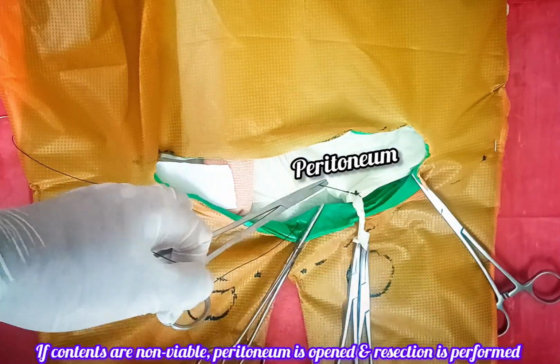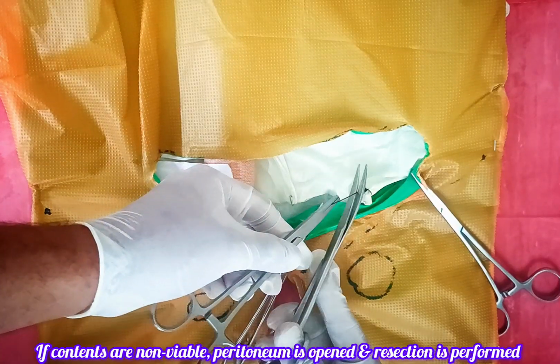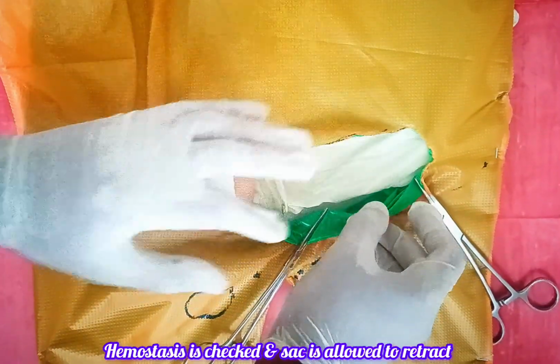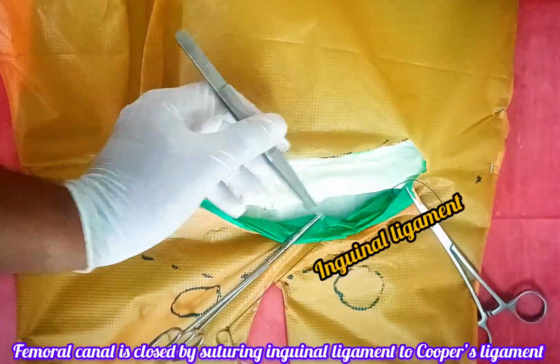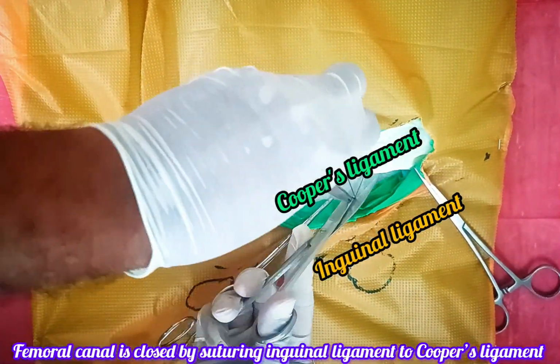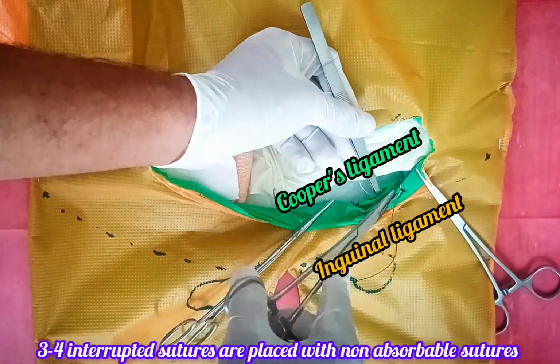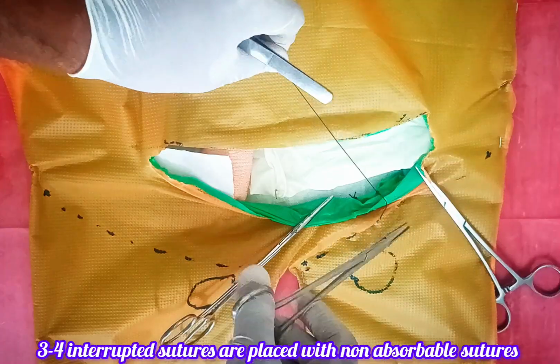If the contents are non-viable, peritoneum is opened and resection is performed. Hemostasis is checked and sac is allowed to retract. Femoral canal is closed by suturing inguinal ligament anteriorly to Cooper's ligament posteriorly. Usually 3 to 4 interrupted sutures are placed with non-absorbable suture materials.